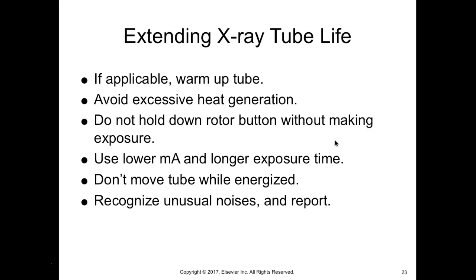You want to use a lower mA and longer exposure times. Also, don't move the tube while it's energized. I don't know why you would ever do that, but don't ever do that. You also want to listen for any kind of unusual noises and report it so that it gets fixed before it blows up. So that is your basics, very, very basic in X-ray production.